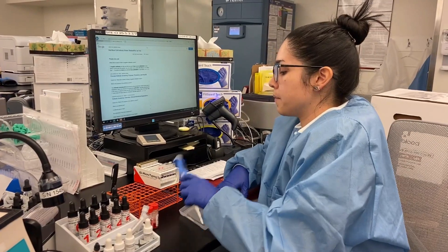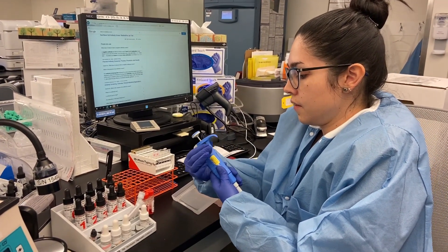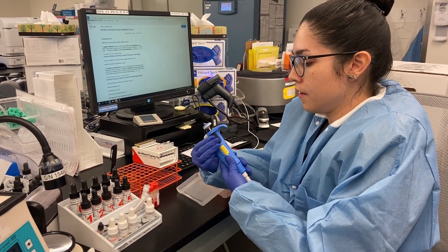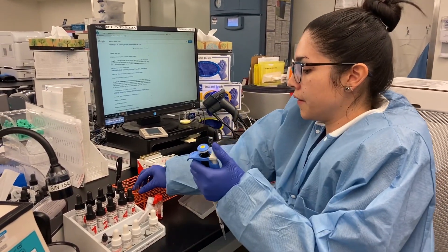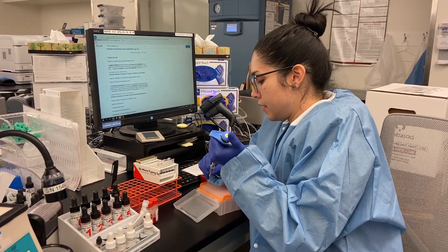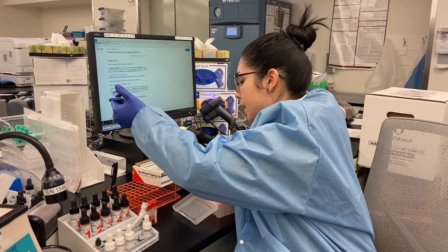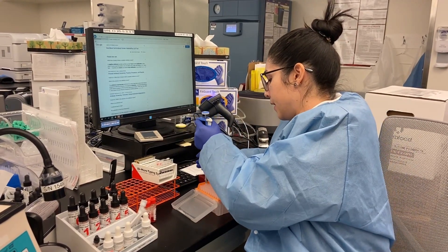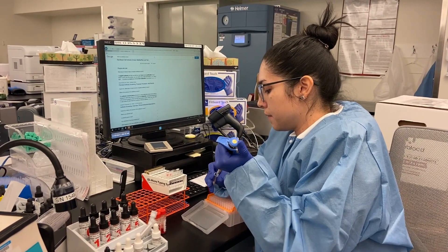Then we grab 25 microliters of patient serum using the pipette. This test can be done two ways: the tube method, using glass tubes, or the gel method. We do the gel method here because it's a children's hospital and we want to use as little serum as possible.